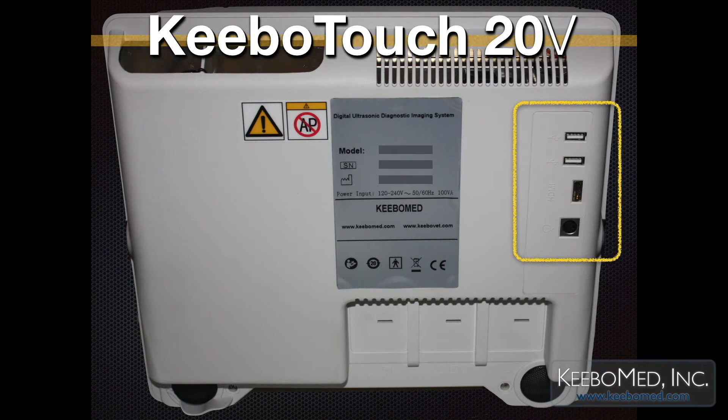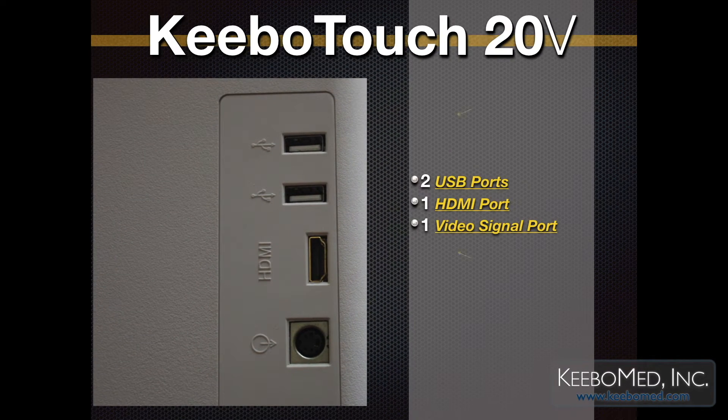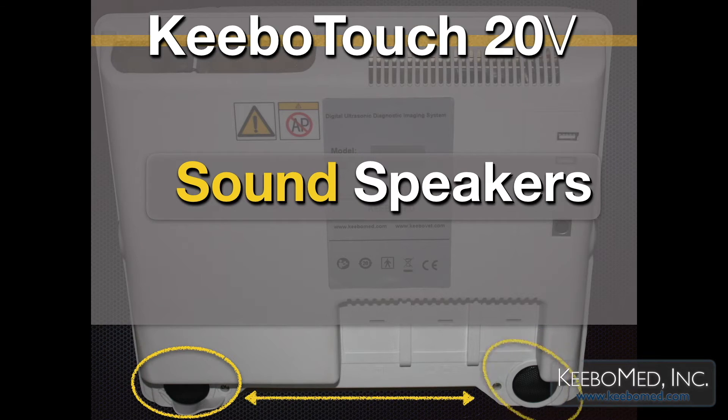Kibo Touch 20V has many ports on the back of the ultrasound: two USB ports, one HDMI port, and one video signal port. Additionally, the Kibo Touch 20V has sound speakers located on the backside.